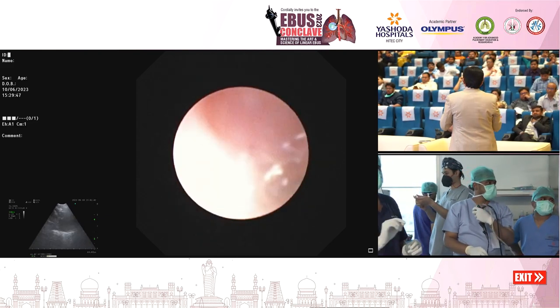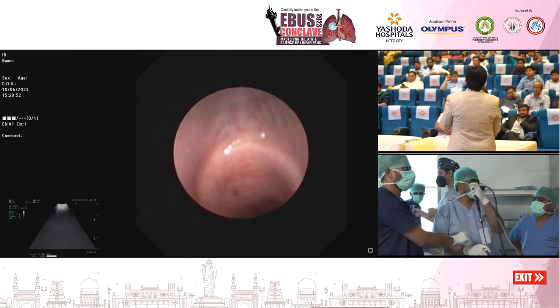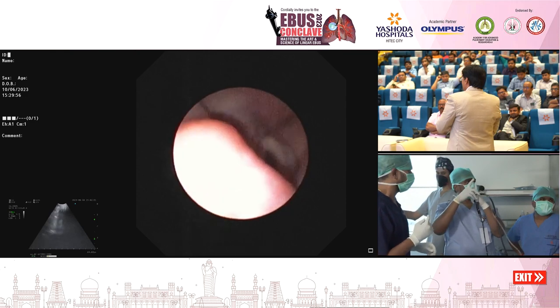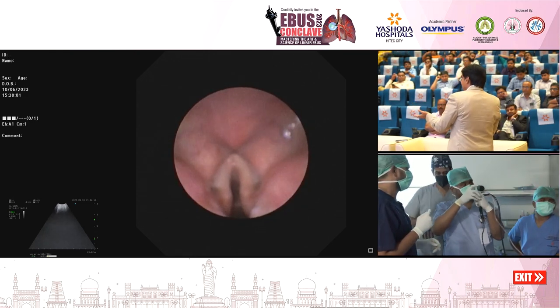Nevertheless, I wouldn't recommend that we do biopsies in all cases. I think you should not go home with the message that we do biopsy in all cases. We do not do it. We only do it for a small subset of people where, as I have said, ROSE is inconclusive. So only then we do.